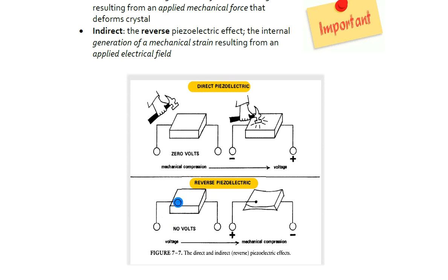That electricity is going to cause a mechanical deformation. So it's going to cause that synthetic quartz, that synthetic crystal, to vibrate. And those vibrations are going to create sound. And that's what's known as the reverse piezoelectric effect.